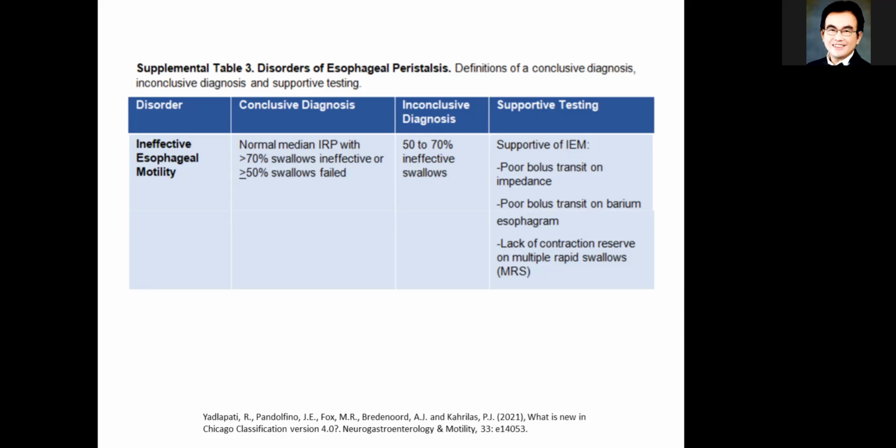So it's very important that although the name is minor disorder, it may not be that minor if, say, there is a lack of contraction reserve, which means that if you do a fundoplication in this patient, there's always a potential risk that they can develop dysphagia. So I think there are a lot of unclear points also in Chicago.